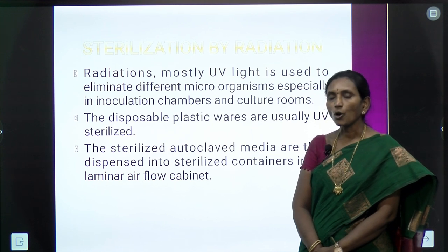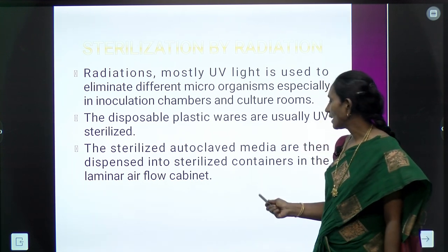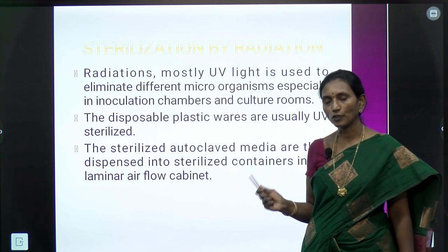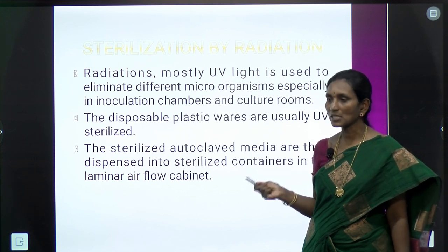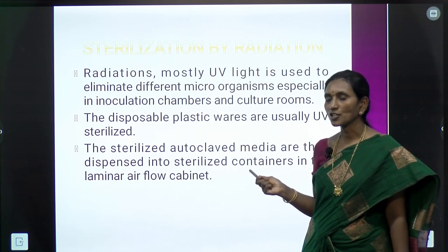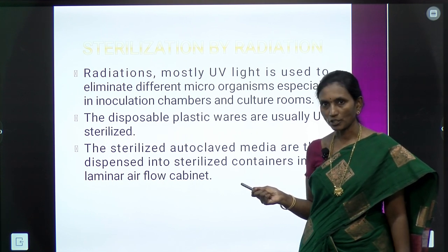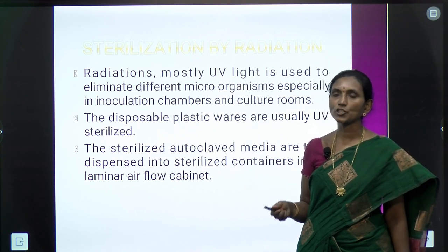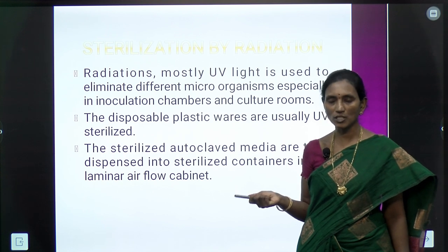The sterilized autoclaved medium is then transferred into sterilized containers in the laminar airflow cabinet. In the laminar airflow cabinet, radiation in the form of UV light is provided. This radiation is useful for sterilization during inoculation. Inoculation means transfer of sterilized explant onto the nutrient medium, which is also sterilized.